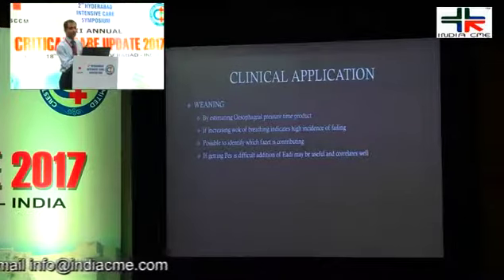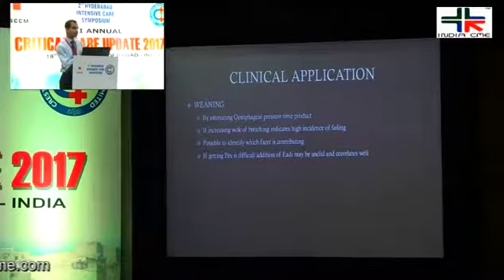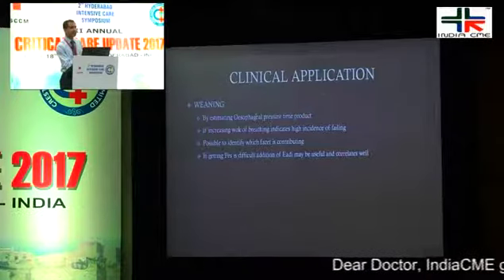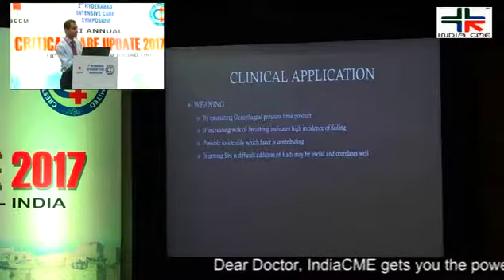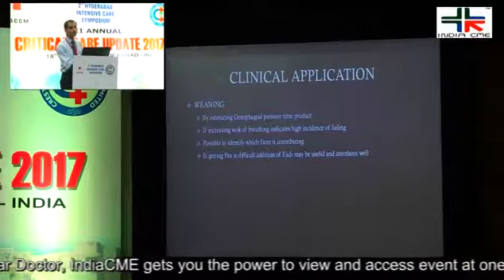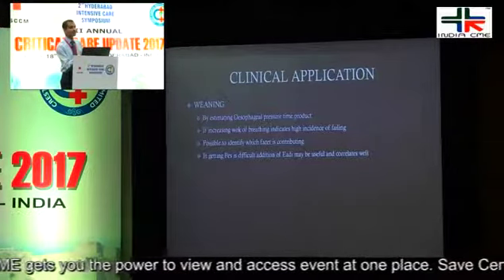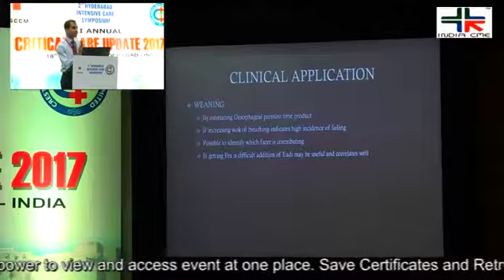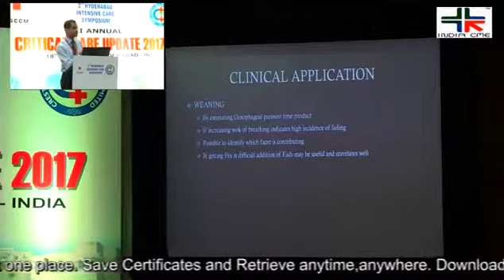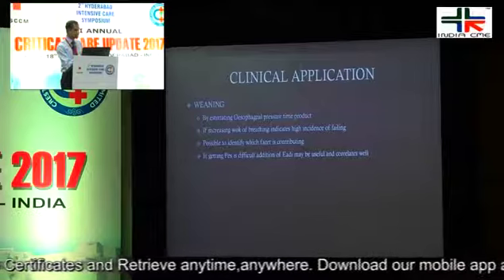And over the next few cycles of respiration, if the work of breathing continues to increase, then it is probably an indication that the patient is not in a position to be weaned. It also gives us an indication of which component of work is causing the delay in weaning, whether it is the elastic component, resistive component, and so on, in patients in whom weaning is a problem.